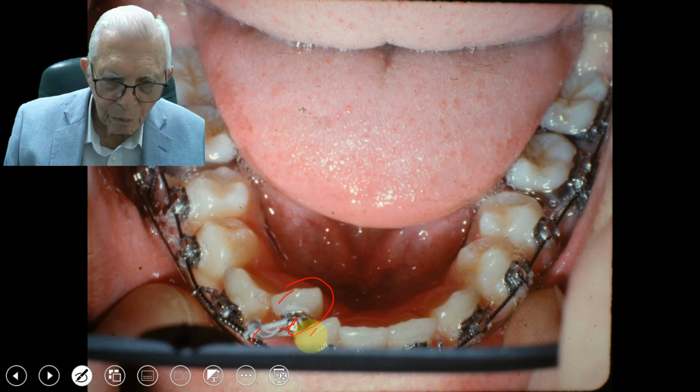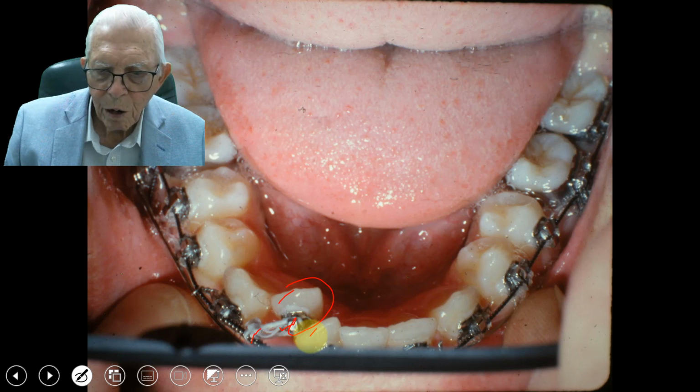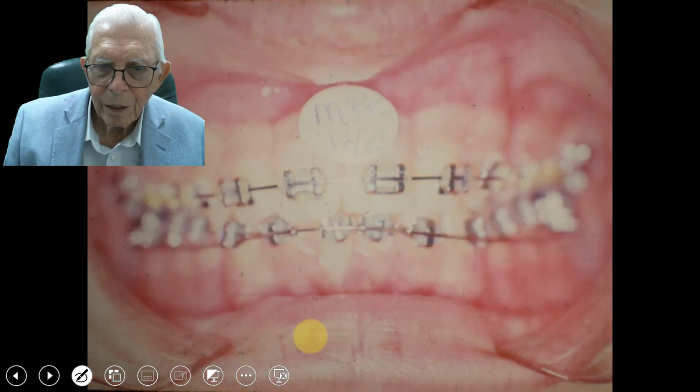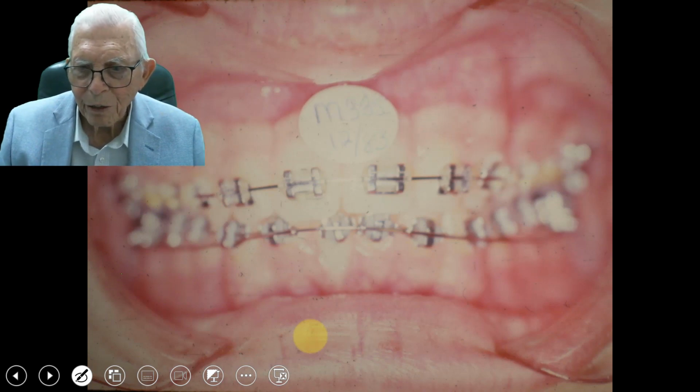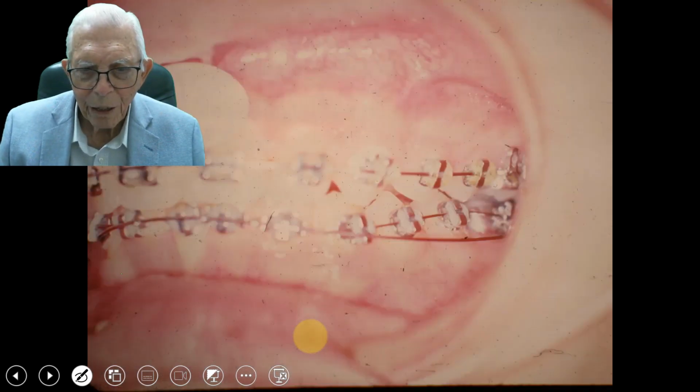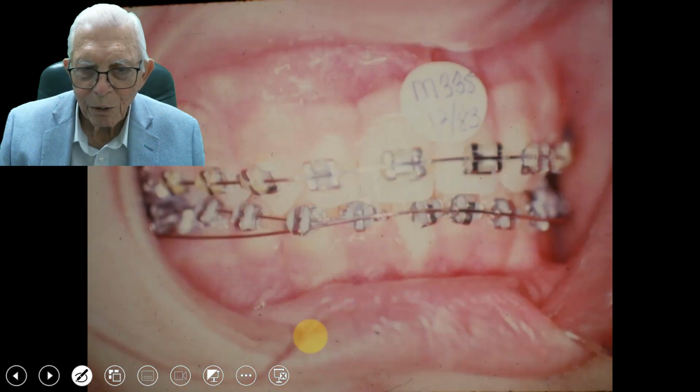Now we pulled it on with an elastic thread, I think, in that area, but we still have the intruding wire on there. Now that's a messed up slide, but we've got it on the only one I had on that. This is messed up also, but we still got the intruding arch on there.